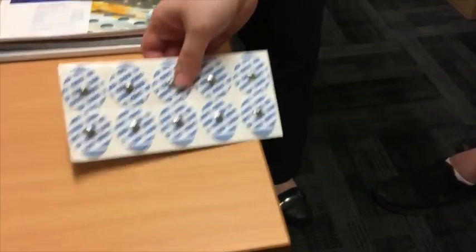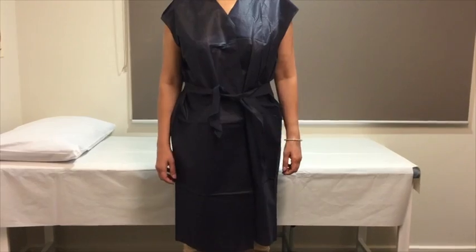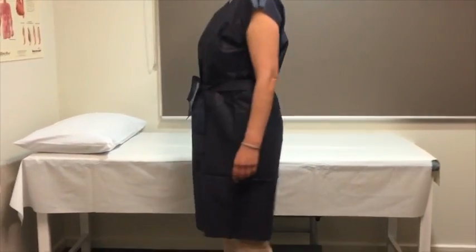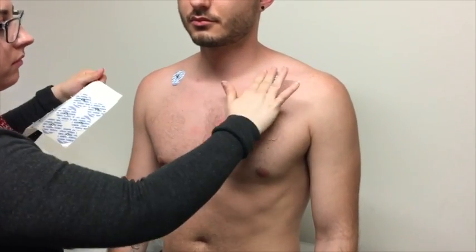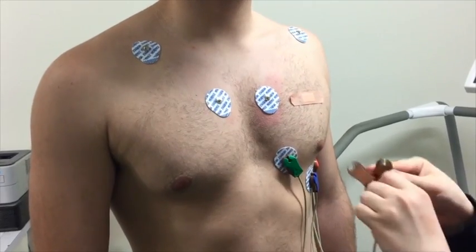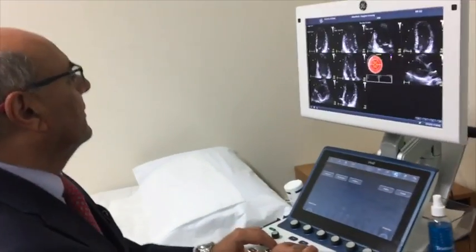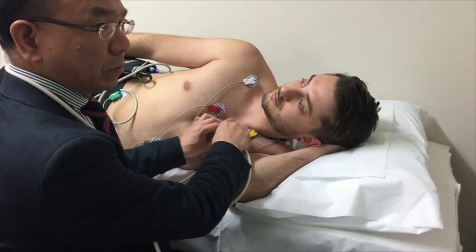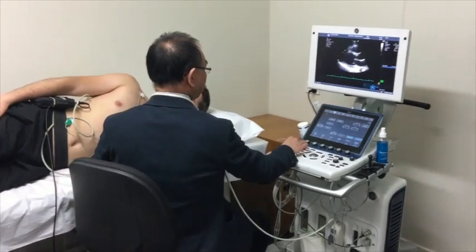The technician will place ECG electrodes on your chest — hair may need to be shaved off. Women can wear a disposable single-use gown. When you come into the stress room, you may find two other health professionals: one is a doctor, usually a cardiologist, and the other is an echo technician who will be performing the ultrasound of the heart.